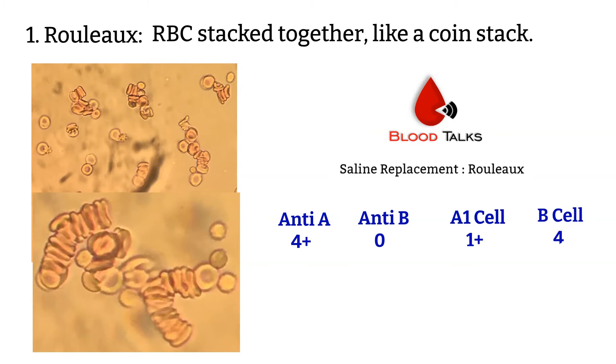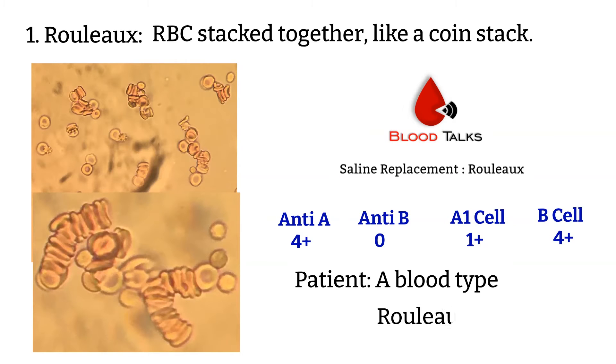In this case, you can report that the patient is blood type A, and it would be wise to enter in the comment section that Rouleaux was observed.